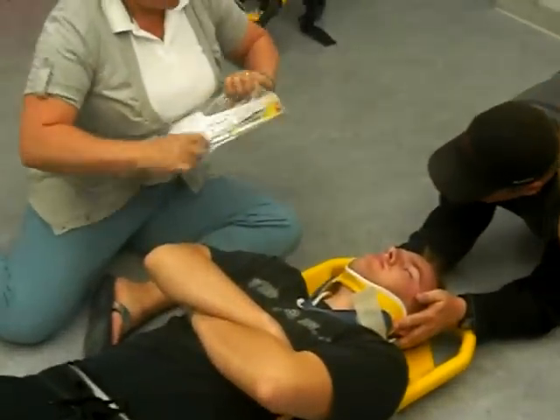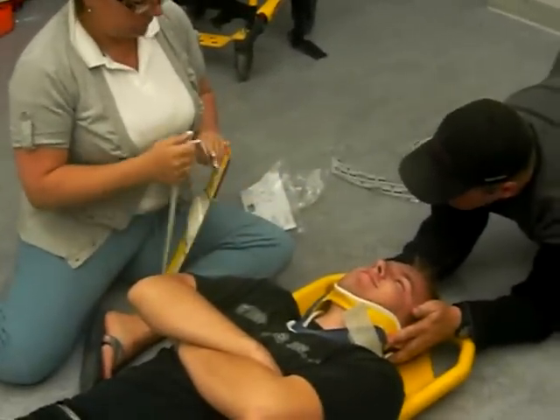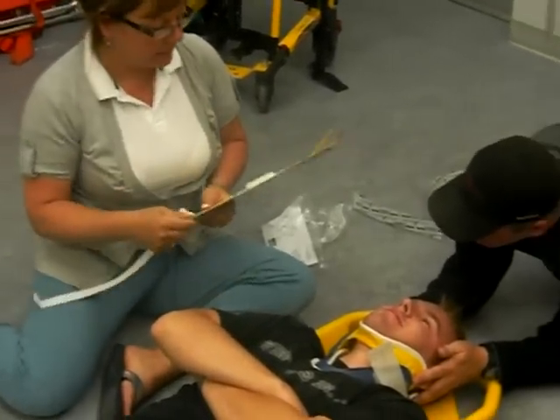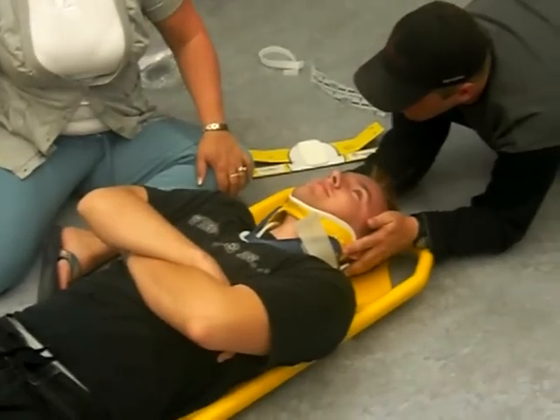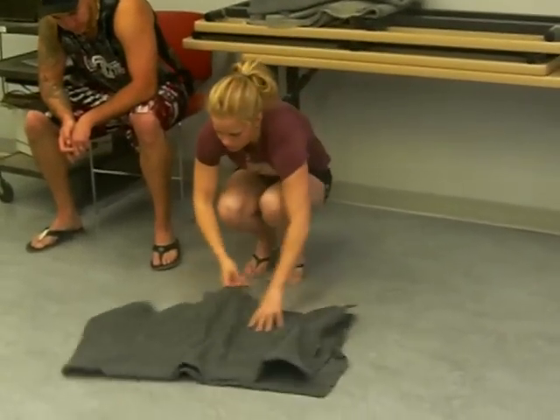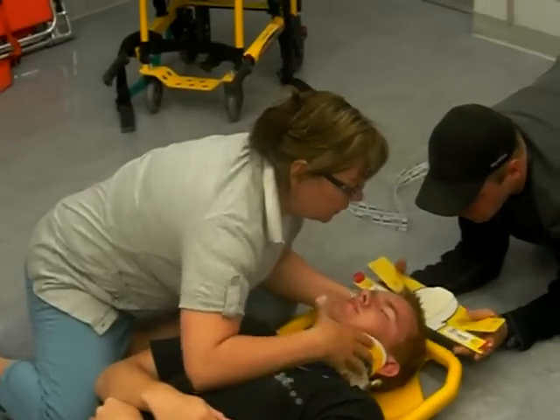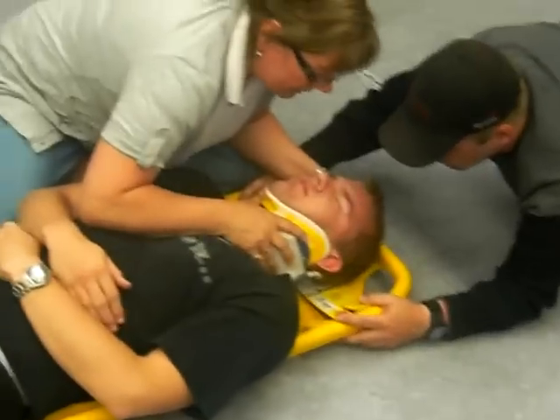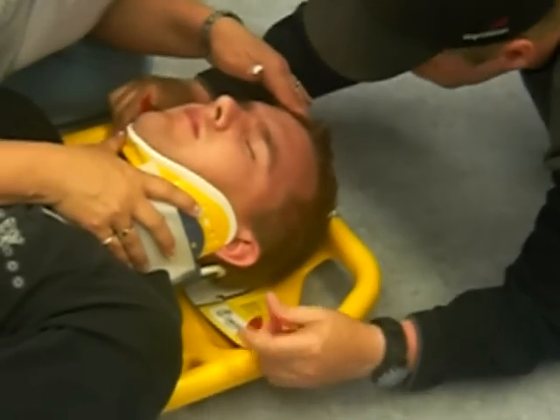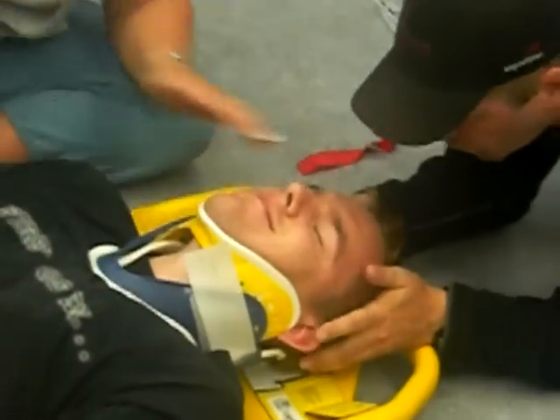The headbed has a pad on it, and I'm going to hold his head. This here goes across here. Can you roll a blanket for me, Ashley, please? It's going to go around his head for the void — just roll it the length. I'm going to grab his head — you're going to place his head right on top of the pad. Pull those red tabs and stick them down, and push them down on the carpet. High on the head. Thanks, Ashley.